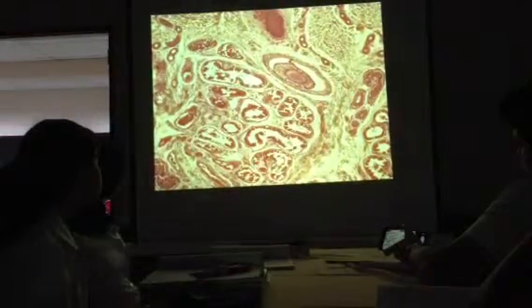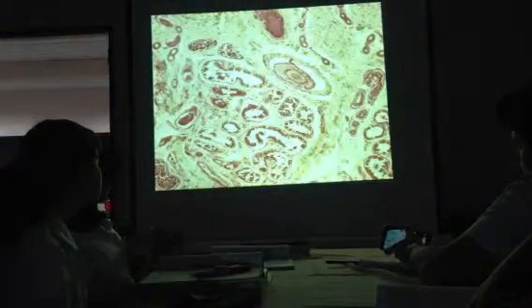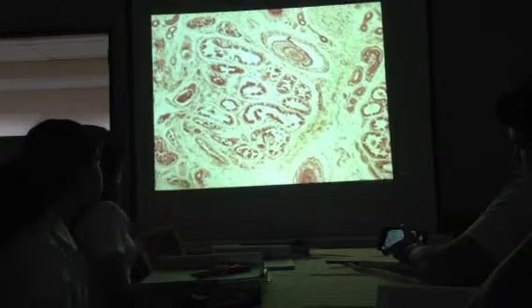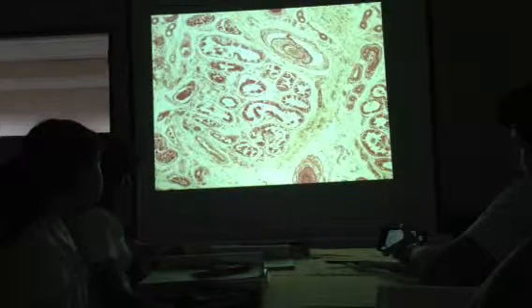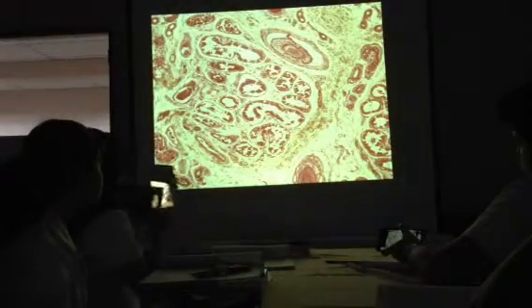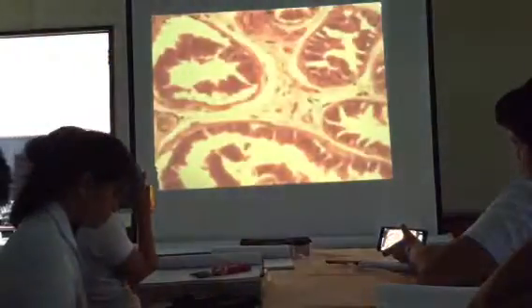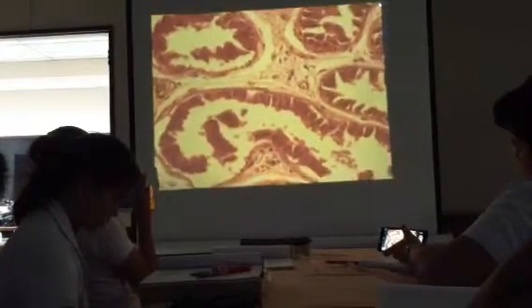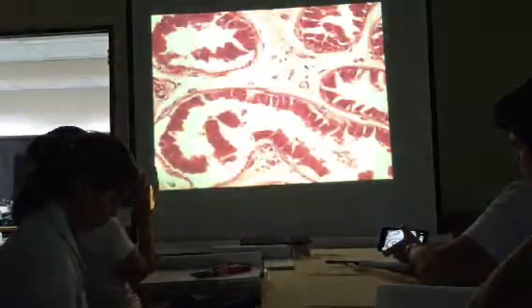How about those glands? We are looking at the histology of the armpit. Axillary skin. Those are still sweat glands. The apocrine sweat glands. Majority of the sweat glands in our body are eccrine or apocrine?